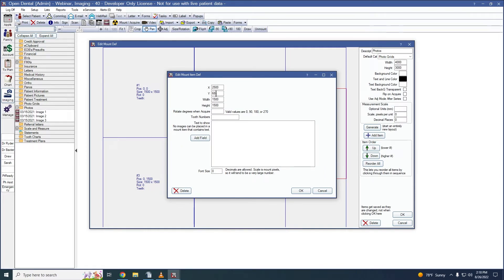To edit an item in the template, we can double-click into that item. X and Y determines the position of the item on the mount definition. Width and Height adjusts the dimensions of our item — let's change its width to 1000 pixels so it fits on our mount. Rotate Degrees when Acquire allows us to set a value for automatic rotation of our item when it's acquired; valid values are 0, 90, 180, and 270 degrees. Tooth numbers can be used to indicate the tooth number usually associated with this item. I also have the option to turn this item into a text box by entering something into the text to show field. This is how we can add text to a mount.